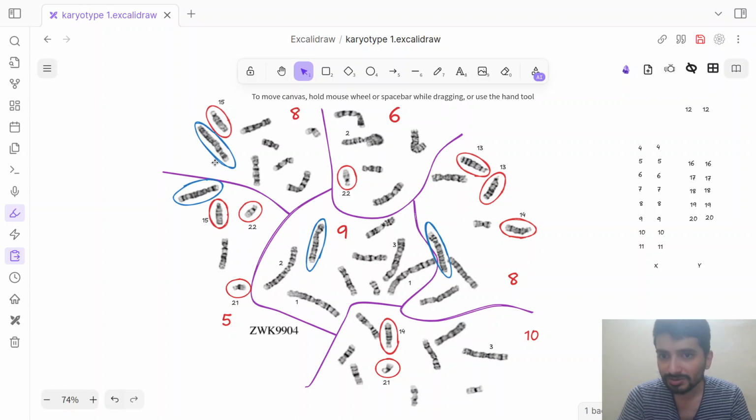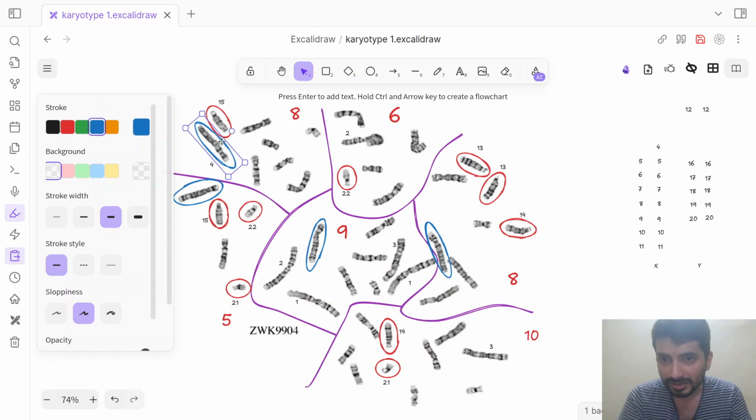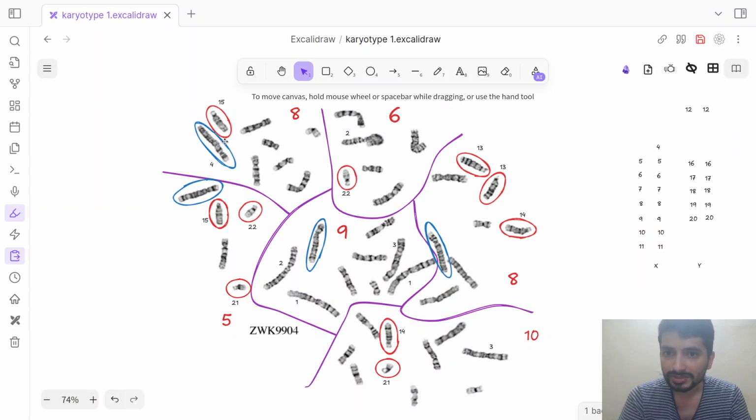So this chromosome here is chromosome 4, and I say that because there is a dark shoulder band right distal to the centromere on the long arm, and there is a similarly staining dark band on the short arm as well. So this is the identification feature of chromosome 4.